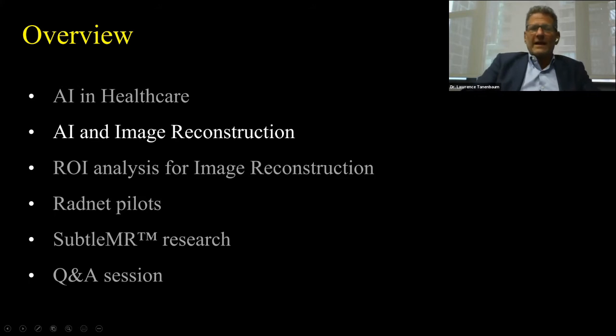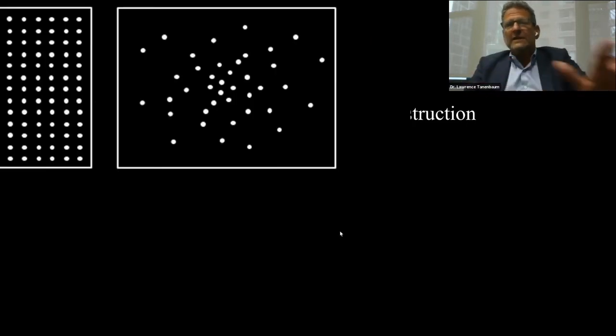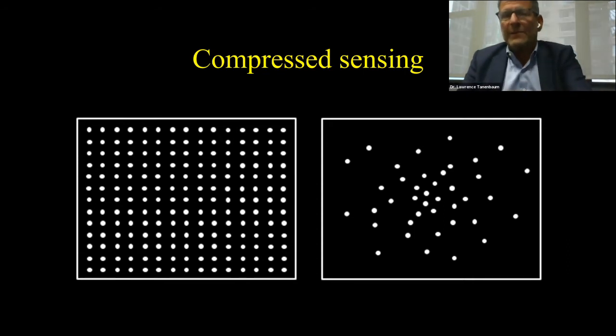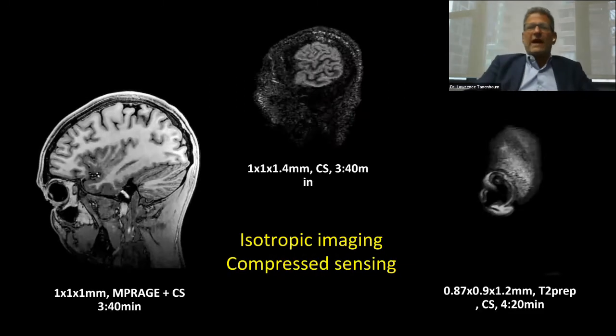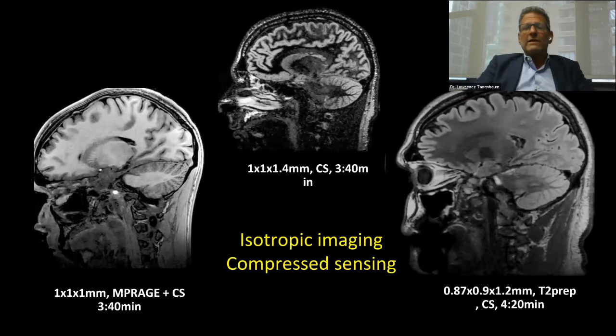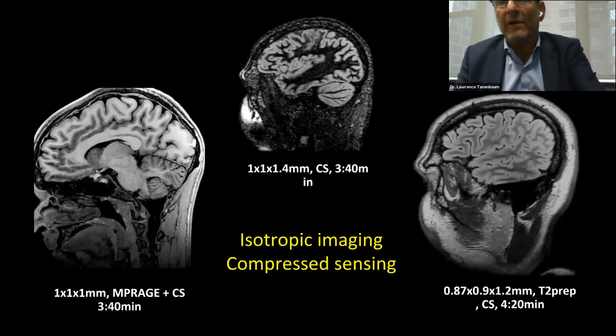All right, so let's come to the second piece of the presentation, and that is an in-depth discussion of artificial intelligence and image reconstruction in radiology. And there are a number of introductory use cases that are out there quite a bit. We'll start out with compressed sensing. Essentially with compressed sensing, we're using machine learning type analysis to vastly undersample k-space and markedly accelerate scan time, but using cleverness to keep the image quality where it needs to be and reduce artifacts. And you can see some examples from our clinical sites and how you can use compressed sensing to get a more isotropic acquisition without paying a penalty in terms of scan time, at least not a very high penalty in terms of scan time.